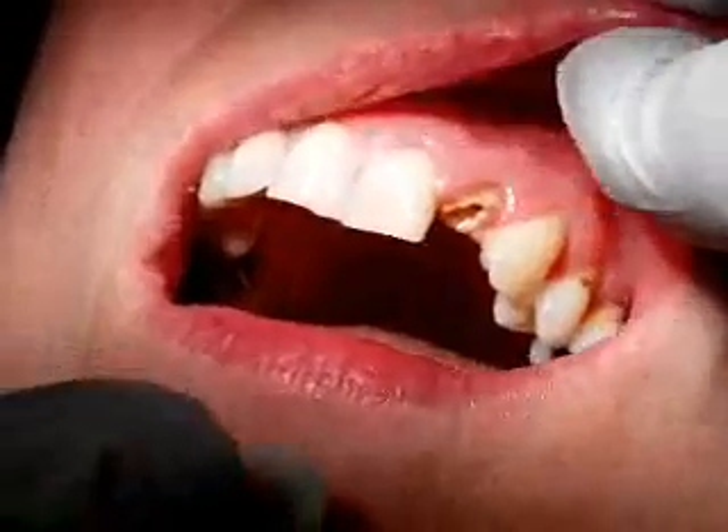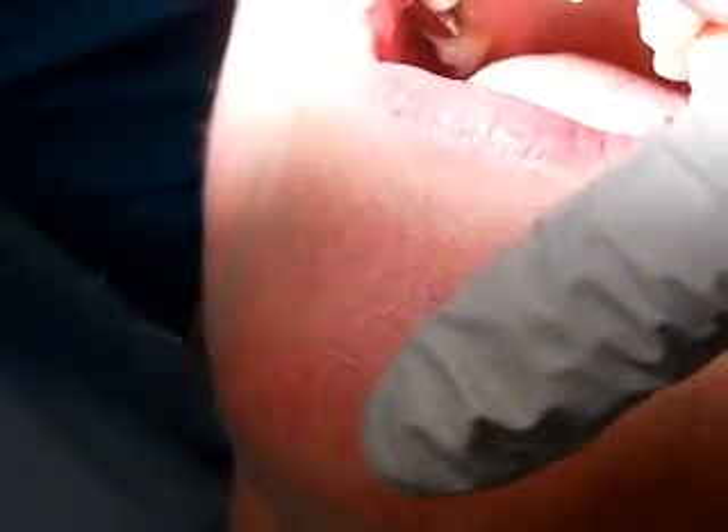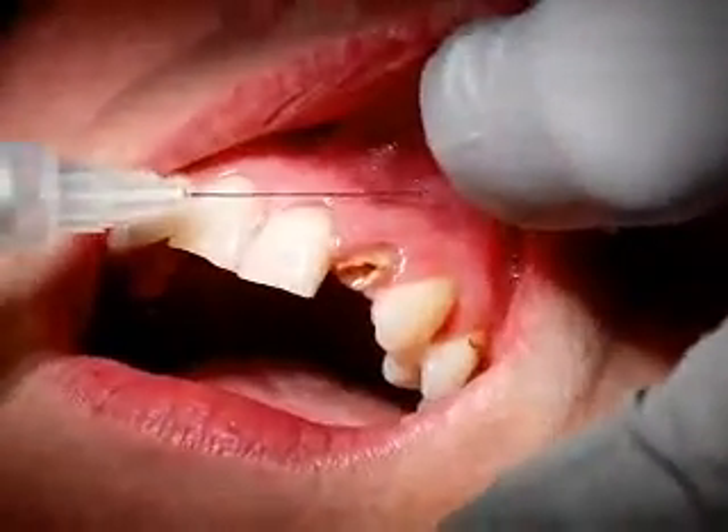So using the bevel — your bevel's there, indicated by the angle, by the little black arrow here. So your bevel is there. Your bevel's going to want to come in against the mucosa.